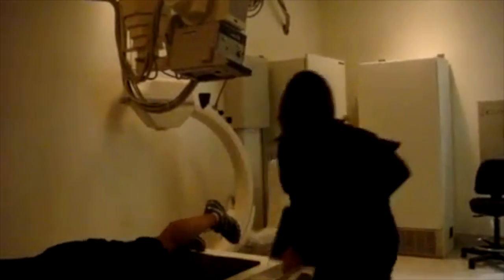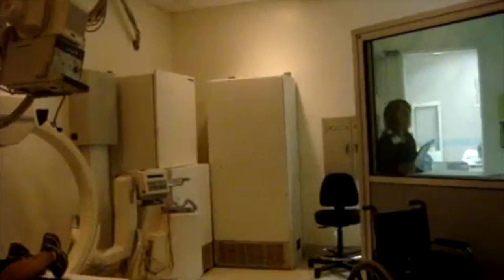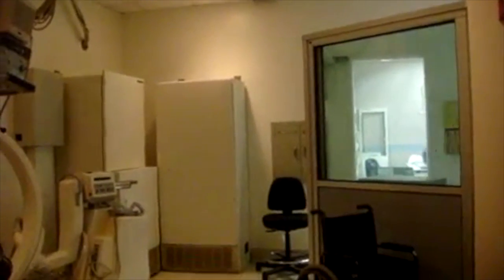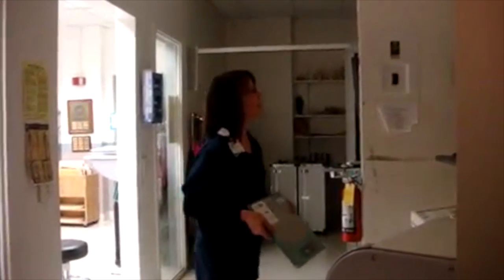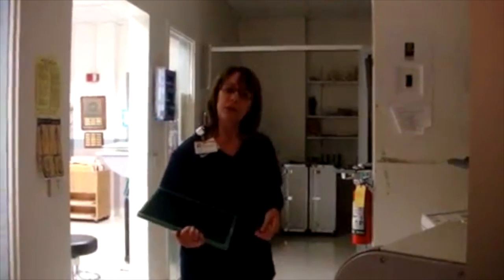Okay. Now I'm going to run my 2 images in the reader and see how they come out. Scan my first image, pop it in the reader. Oh, that looks good. I'll take my next cassette, scan it, pop it in the reader. Okay, looks like we're done. And now I'll be critiquing my images in my evaluation.